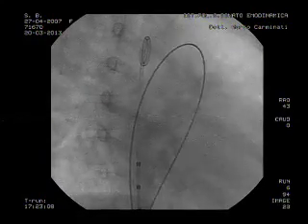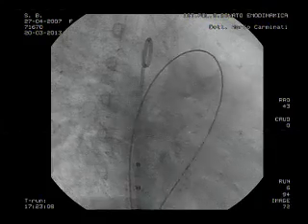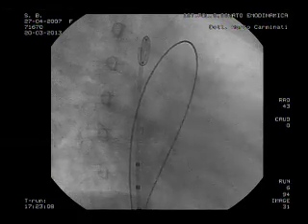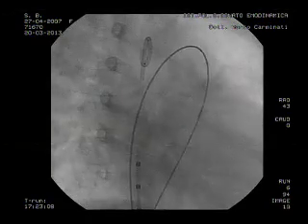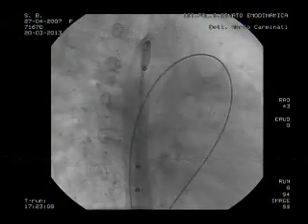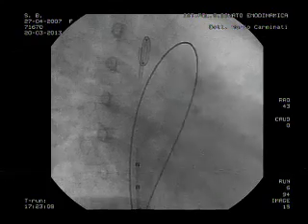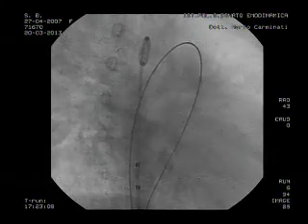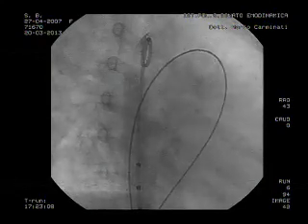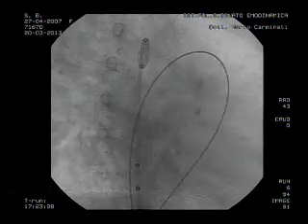Who suggested it? Shaq? Or Carlos? I would use an ADO1 because, as Shaq says, I have no choice, either an ADO1 or a coil. Actually, no, we have now the ADO2. Yes, although we are a third world country, this ductus is designed for the ADO1 if you didn't have an ADO2 or anything. This is the exact morphology. So why wouldn't we just put the device that was designed for it?